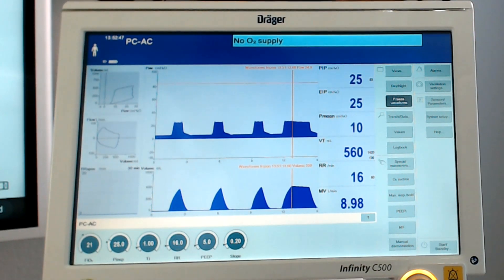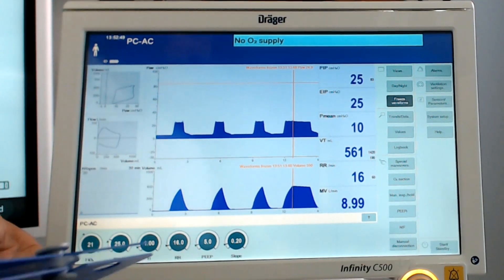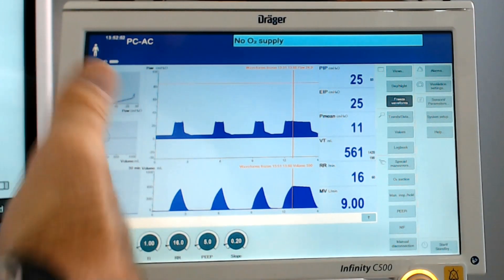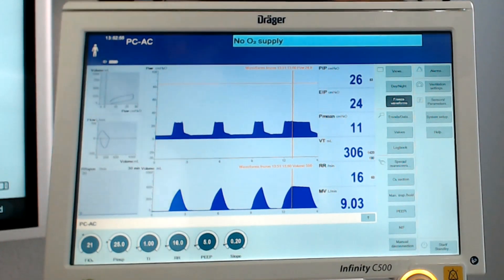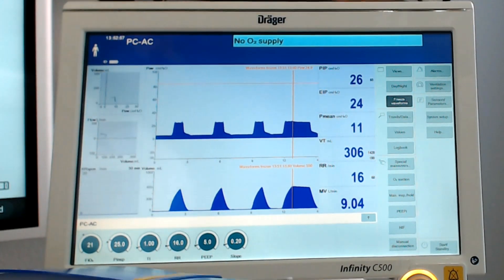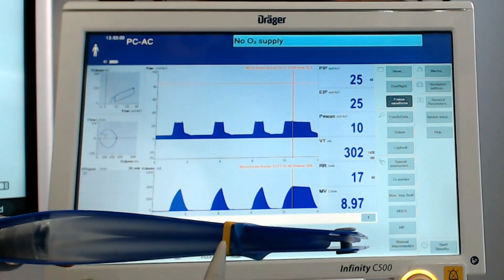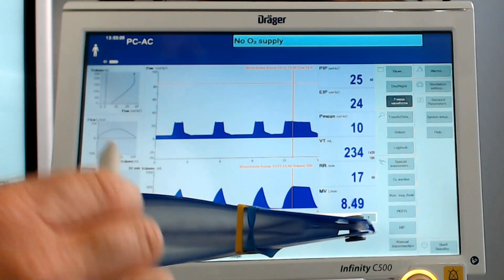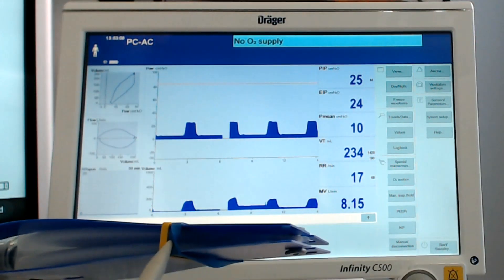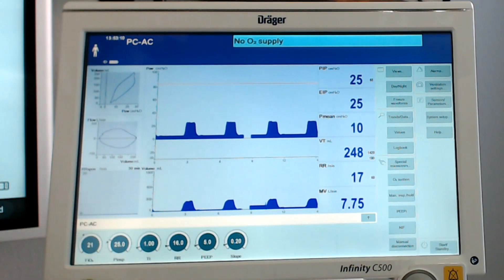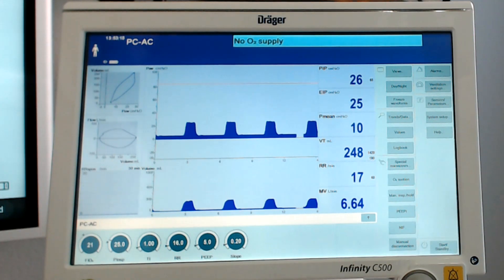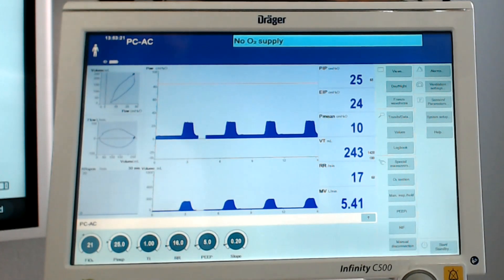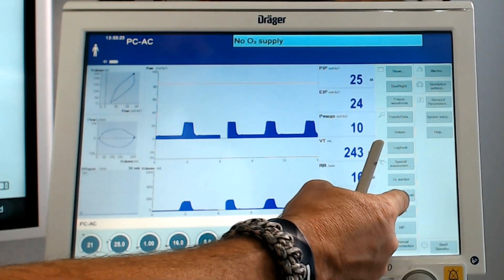Now let's reduce the compliance of this lung by taking another rubber band, like we did in the volume control video. I've added another rubber band, so we now have two rubber bands and this test lung is now less compliant than before. This is going to illustrate ARDS, a developing pneumonia, pulmonary fibrosis - anything associated with a reduction in alveolar compliance. Now we do an inspiratory hold.